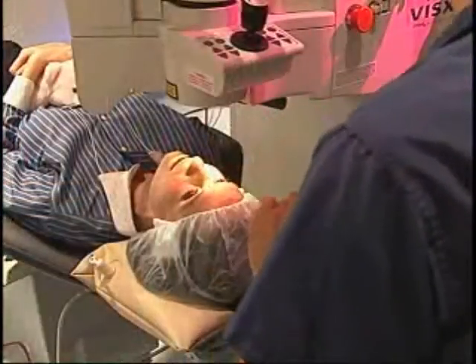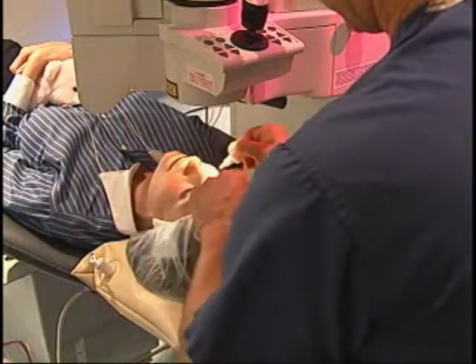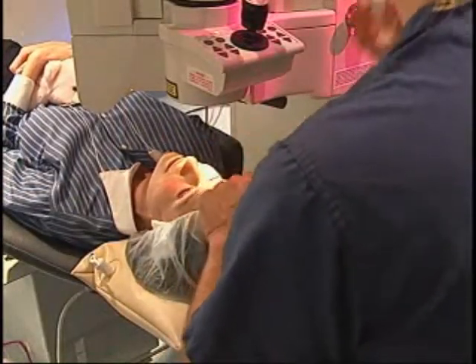Following the treatment, the flap is floated back, carefully realigned and secured in place without the need for stitches. The entire process is then repeated if the other eye is being treated. Patients routinely report feeling more pressure on the second eye. We believe this is due to protective effects of adrenaline during treatment of the first eye.